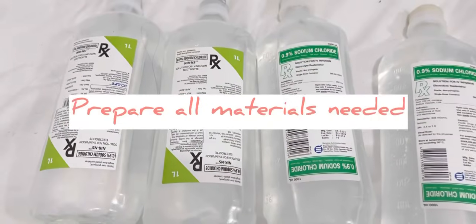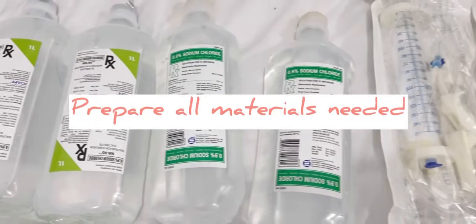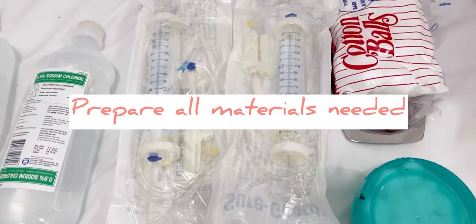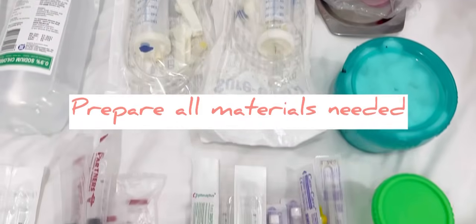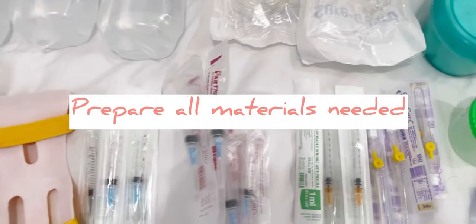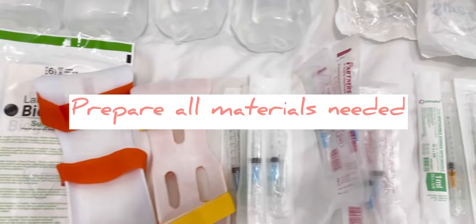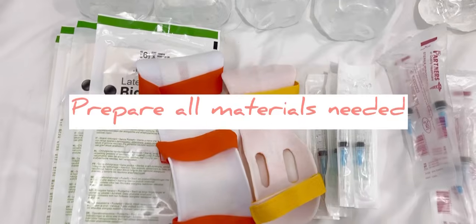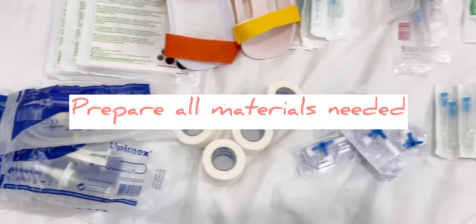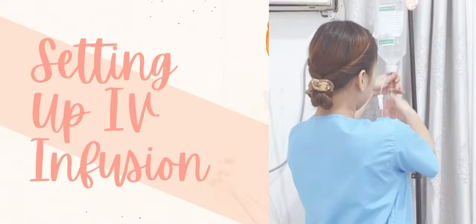Then, before proceeding to the procedures, we will be preparing all the needed materials, which are the correct IV solution, administration set, extension tubing, alcohol, disposable gloves, tourniquet, arm board, non-allergic tape, IV pole, sharps container, sterile gauze sponge, transparent dressing, and tag time tape. Now we are ready to proceed to the following procedures.